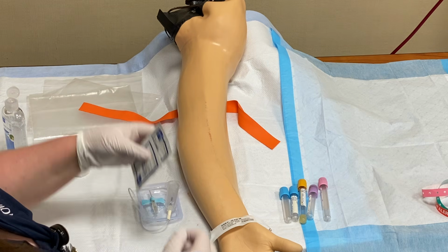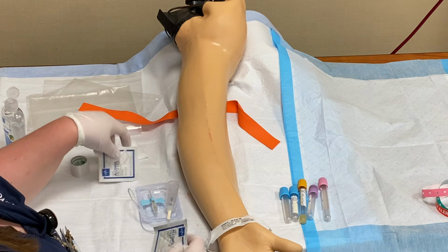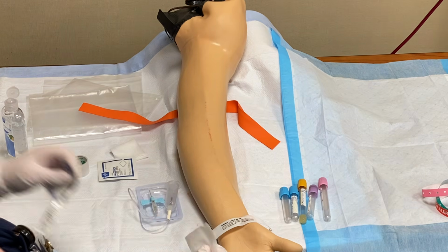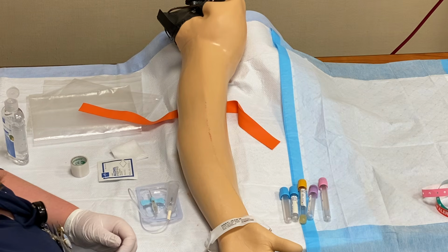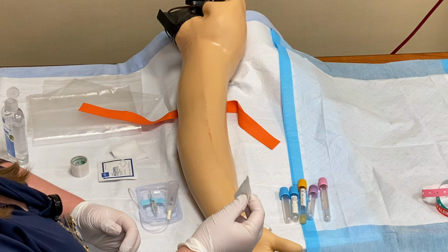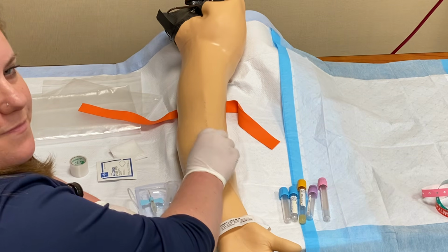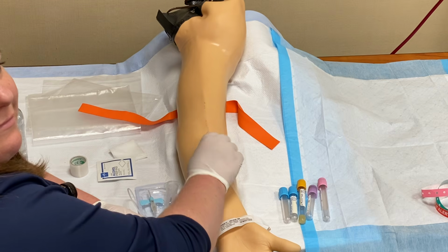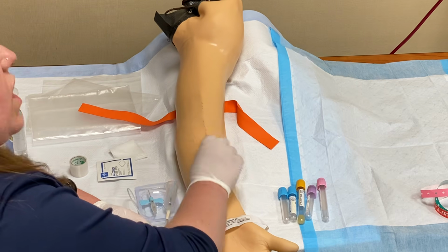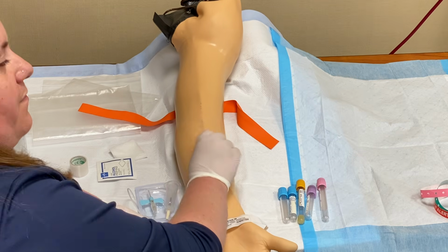So to clean her arm for phlebotomy, I'm gonna use 2 alcohol wipes. I'm gonna clean for a total of 30 seconds, but I'm gonna do each wipe twice. So I'm gonna get my first alcohol swab ready, and I'm going to clean the area of insertion for 15 seconds. Watching the clock to make sure that I actually have 15 seconds.